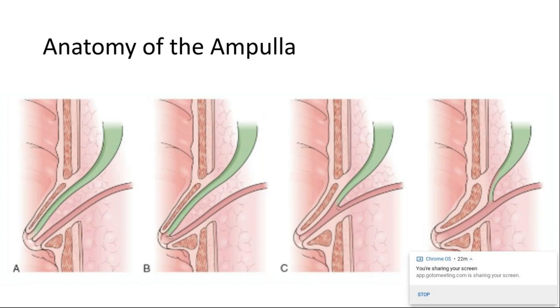Orientation refers to the approach to the bile duct or pancreatic orifices using the scope. In general, orientation is affected by scope position, be it short or long, sideways angulations, and duodenal anatomy. Now, with a short scope position, the papilla can be seen in a proper en face position in about 95% of cases. When there's distortion of the duodenum or a periampullary diverticula, adjustment of the scope position is necessary to maintain proper orientation and enable cannulation. Similarly, when you're trying to get into a biliary stricture, the orientation of the accessory or guide wire inside the duct can be optimized by moving the scope tip and by advancing or withdrawing the accessory or catheter.